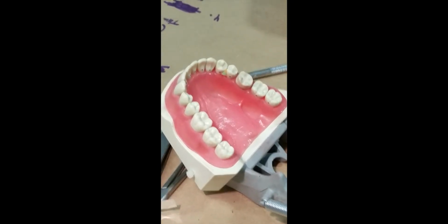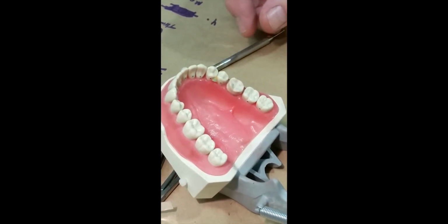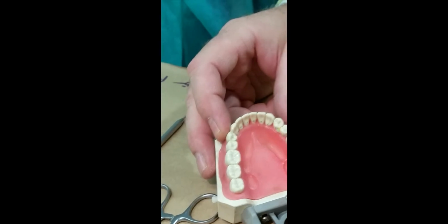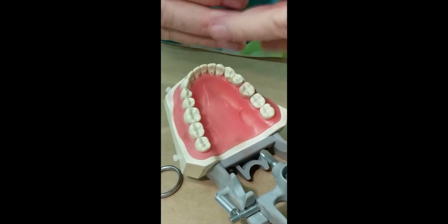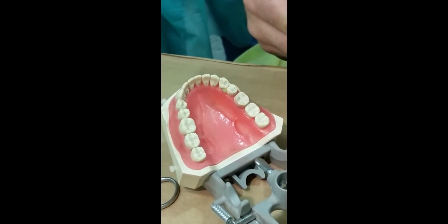Okay. So we've gone through the steps of cleaning it off. You've got the preparation on the tooth. You've got the gold crown in your box, or the PFM more likely in the clinic situations, and you're going to try it in. It's wise to take that 2x2 gauze, open it up, and just lay it in the back of the mouth. Lower's usually not too much of an issue.